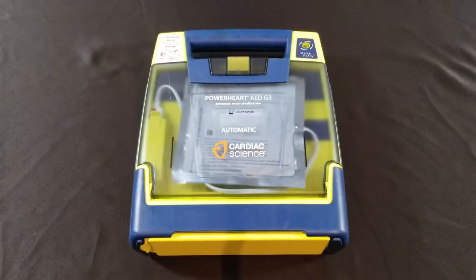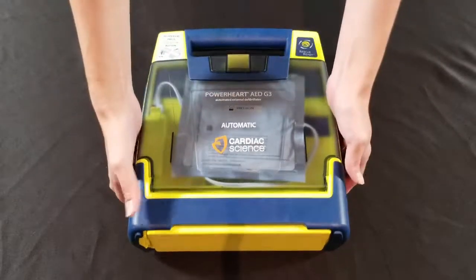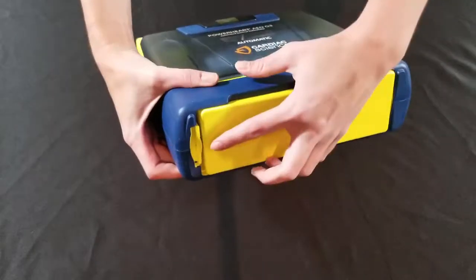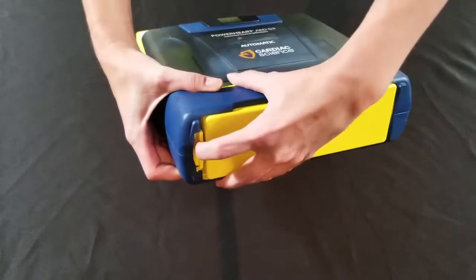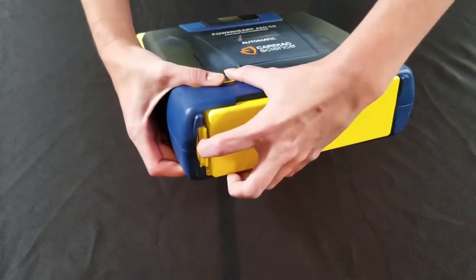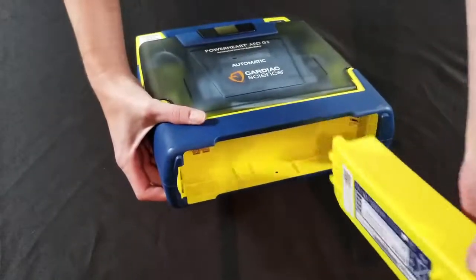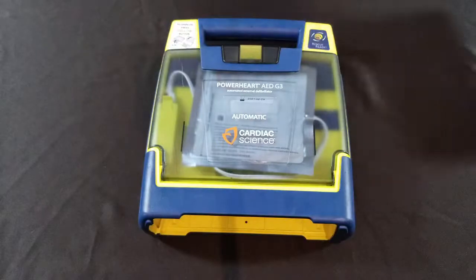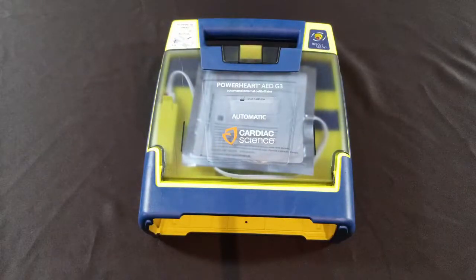Now that you've successfully replaced your pads, we'll move on to the battery. The battery is located at the bottom of the device right here. Press in and pull to remove it — don't be alarmed, it's going to beep at you. Place the old battery to the side so it doesn't get confused with your new one, and be sure to recycle your old battery.